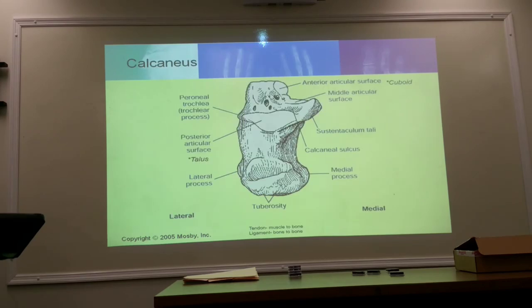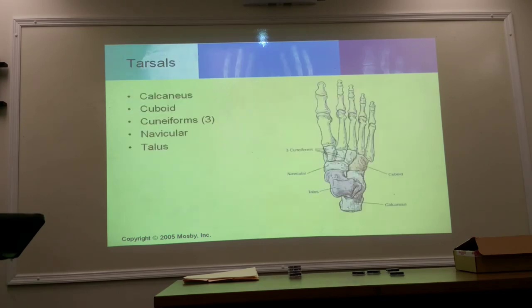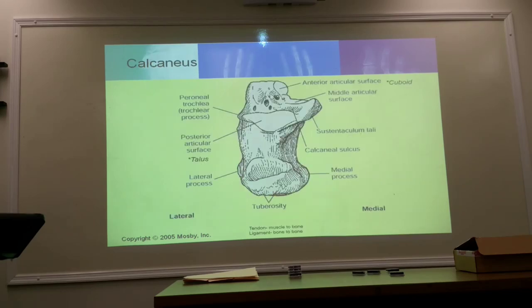So this is labeled correctly. The medial, this is the lateral, this is the left and this is the right. It's based off the book, and the book labeled it as a right calcaneus, so it's actually a left in the picture in the book. FYI. All right, so this is correct.